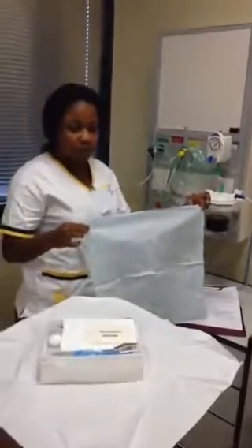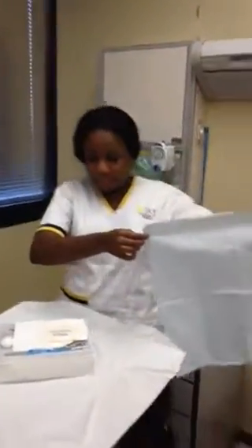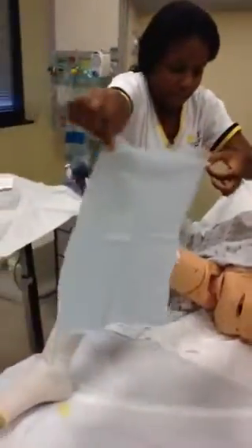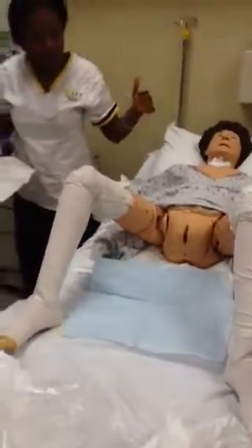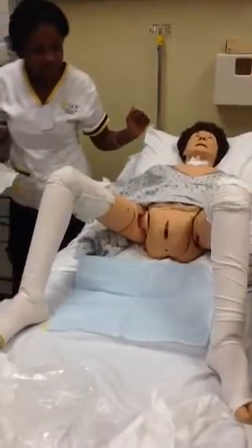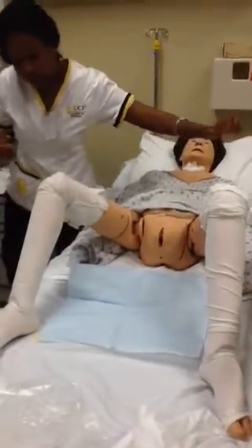Make sure that I don't turn my back to my sterile field. I don't like the way it is, so I'm just going to reach over the patient, not over the sterile field, and fix it. But make sure that I don't touch the patient's legs.